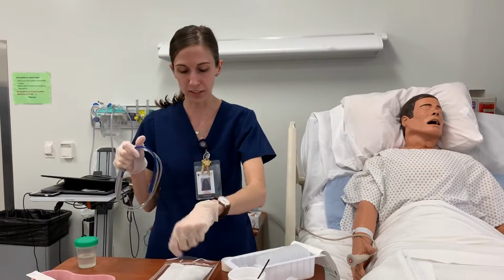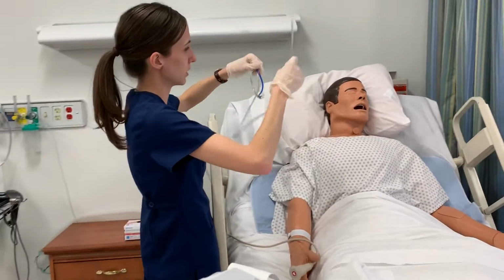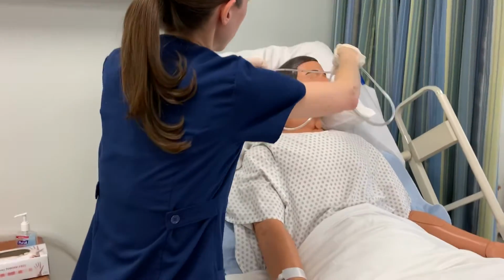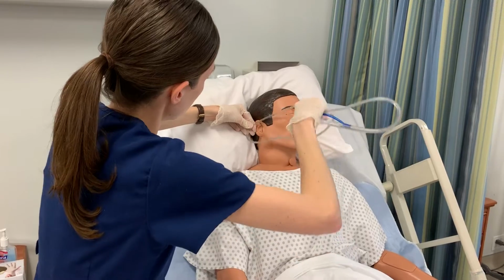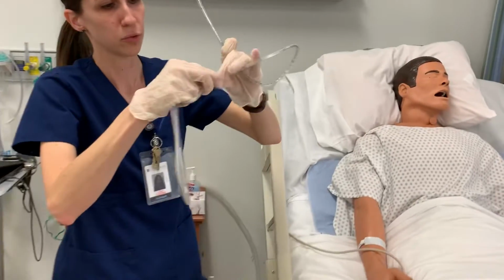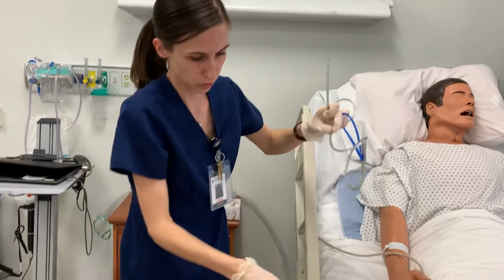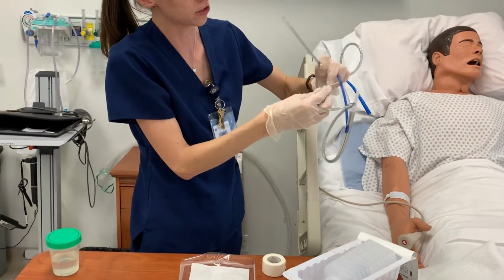You would otherwise apply some lubricant in your package, but I'm going to be measuring my NG tube. I'm going to be working from the tip of their nose to the tip of their earlobe, and then you can then come down to the tip of the xiphoid process. So again, I'm going to mark where I measured that out to. Put my piece of tape so I know where I should be inserting to.